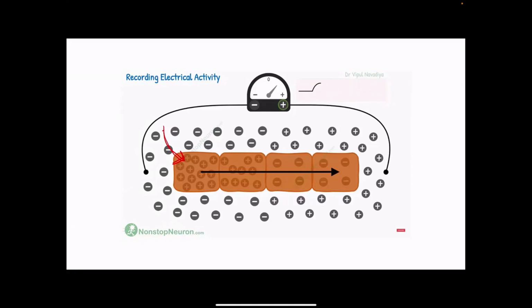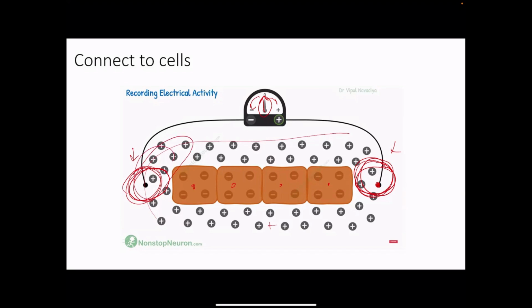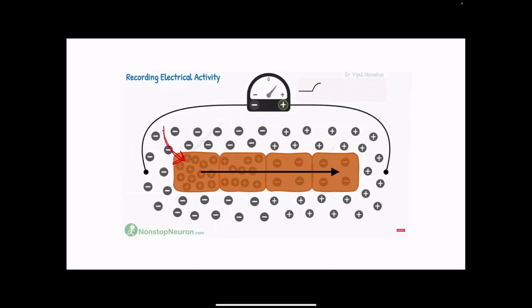So, do you see the difference? We had positive ions here. They rushed inside the cell. So now this part is negative and the inside of the cell is positive. So now there's a difference in charge between this area and this area, so the arrow is going to deflect, okay? This is translated on the ECG paper as an upward deflection. In other words, it means that the depolarization is happening in the direction of the positive electrode.